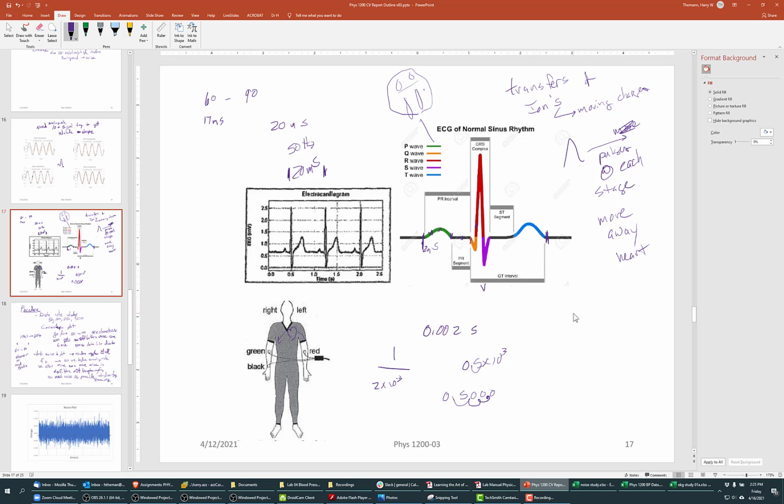So 10 times that to get 10 points. If it's 20 milliseconds, then I want to take a sample every 2 milliseconds, so that's 1/10. So 1 over 2 milliseconds equals 500 hertz. So we need to sample the electrocardiogram output at least 500 hertz.